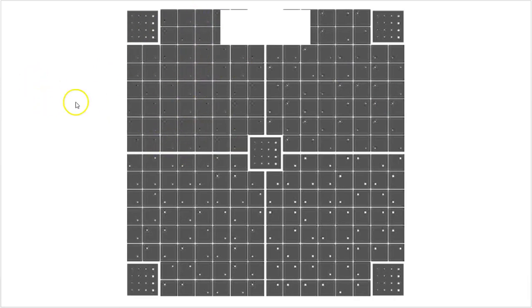So is it bad that there are no white dots in this quadrant? It's not great. That monitor's probably slowly going bad. But hey, remember, you only need 3 good quadrants. So this monitor would pass.